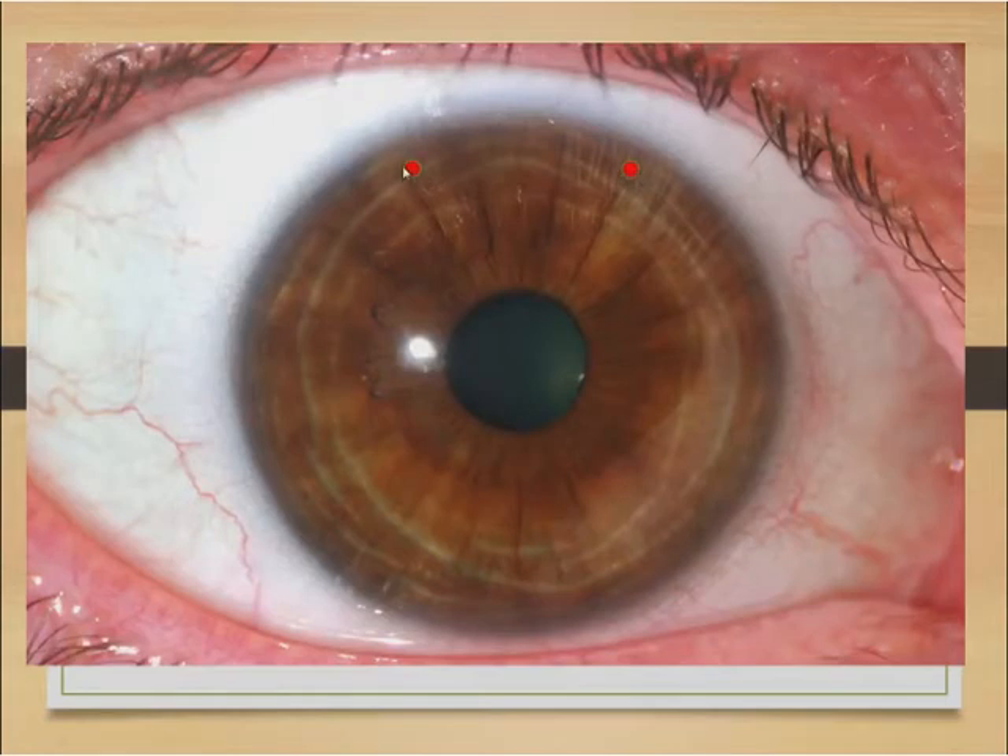What I often do is look at low magnification first, make a mental note of roughly where I'm going to go, and identify a good spot. For example, I'd look for an area that's a bit thin there — that might be a good spot — but maybe a little bit too peripheral unless you're quite experienced.